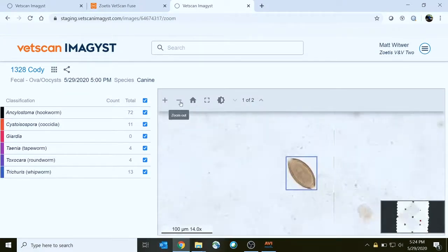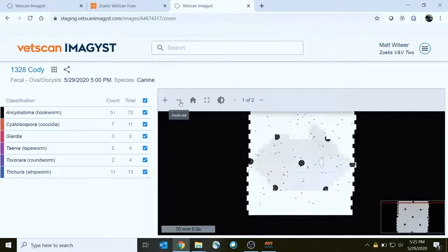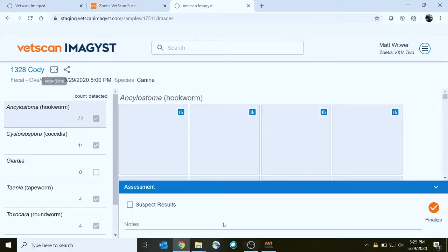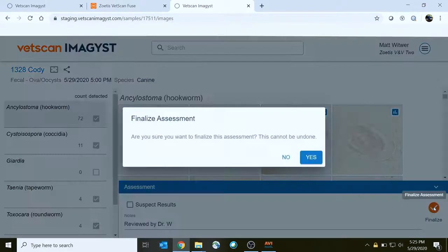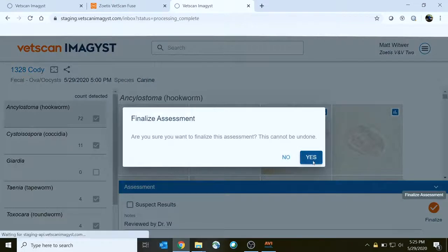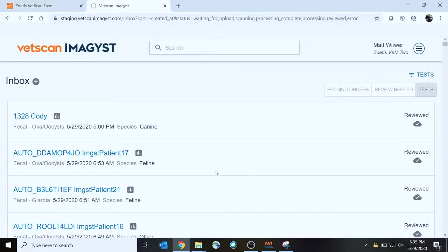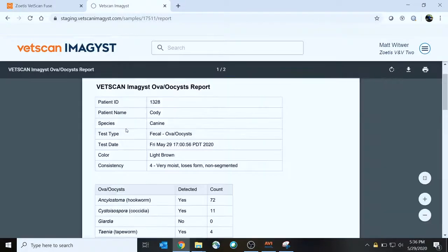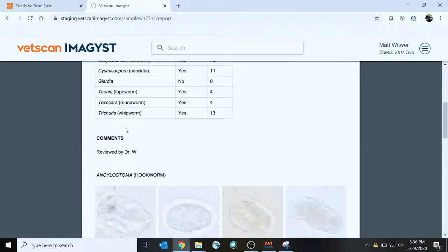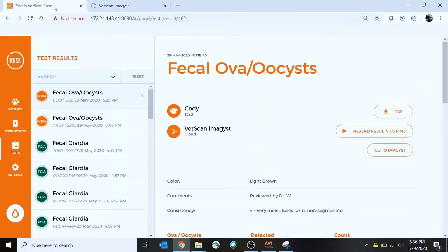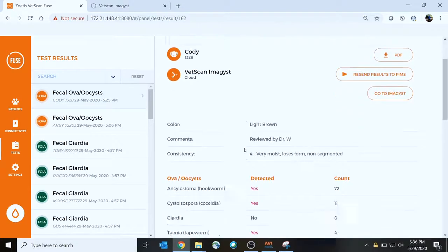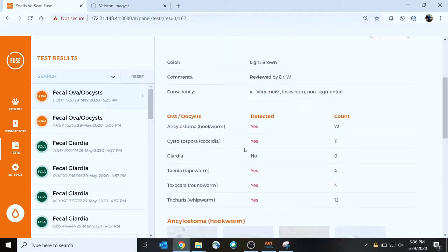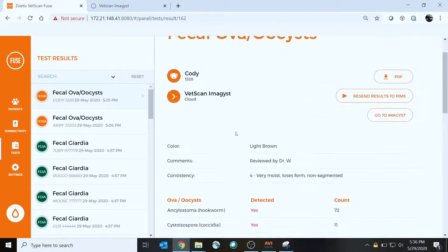Zoom out to see the overall slide view, add any comments, and click on the finalize button. Now anyone can review the results where they want to see them — in the Imagist application with a shareable PDF report, or in VetScan Fuse once the results have transferred over, and next to other diagnostic results.